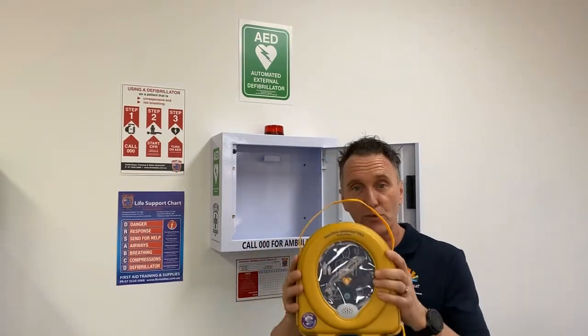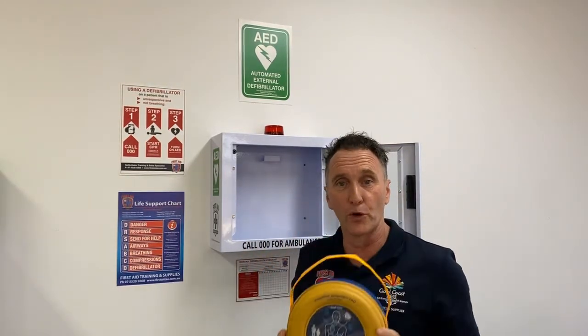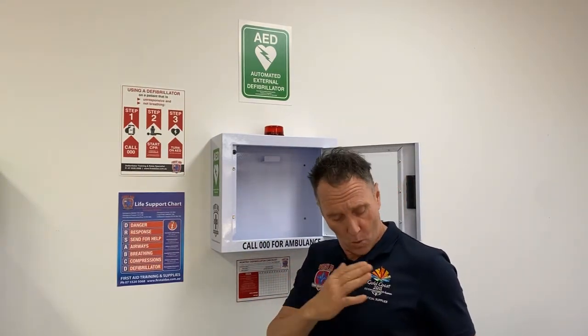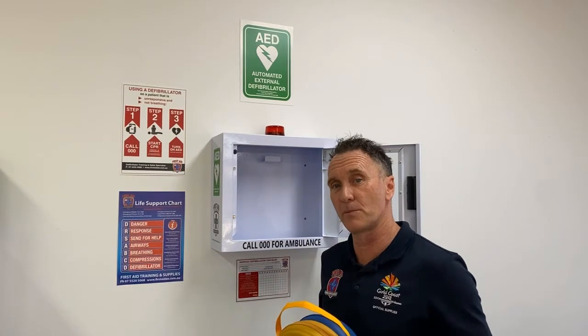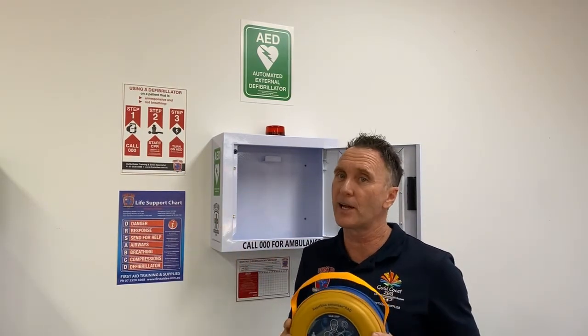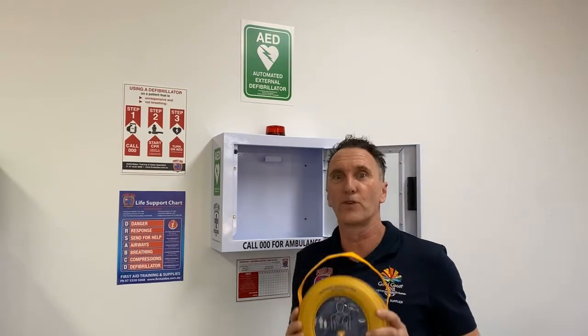It's IP56, which is amazing because it's drop proof, dust proof, heat proof, and cold proof. It's all backed up by a 100% Australian-owned defibrillator specialist in First Aid, Accident and Emergency. We'll give you 8 years warranty on this complete bundle package and also 8 years after-sales and service for the life of your defibrillator.